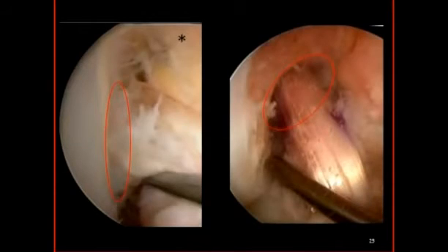The image on the left shows the surgeon demonstrating the attachment of the torn ACL, but that's not where he put the graft. After removing a substantial segment of normal bone and articular cartilage, the graft lies anteriorly and medially with respect to its original position, resulting in an excessively vertical course. Is it any wonder that the graft will collide with the front of the intercondylar notch?